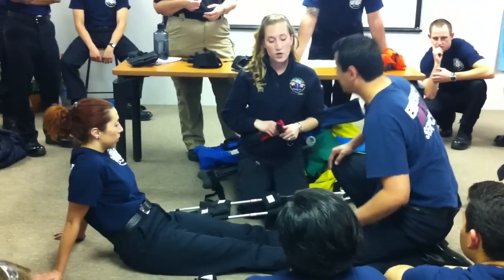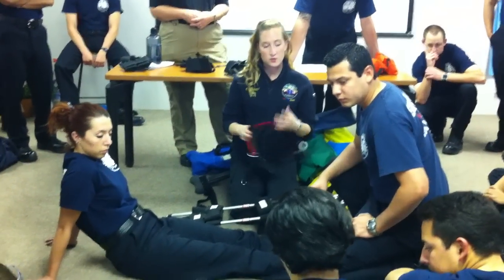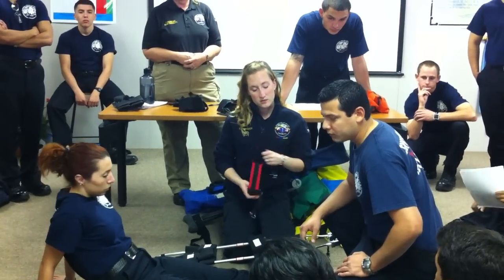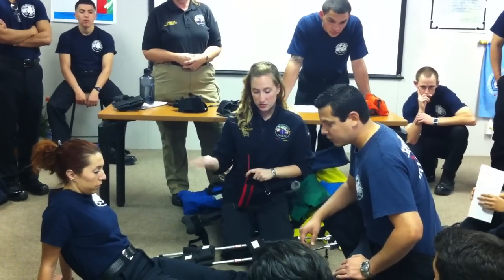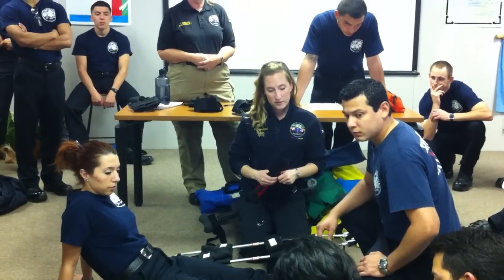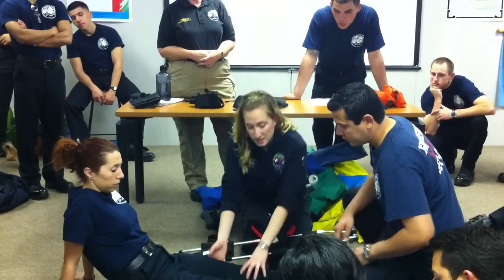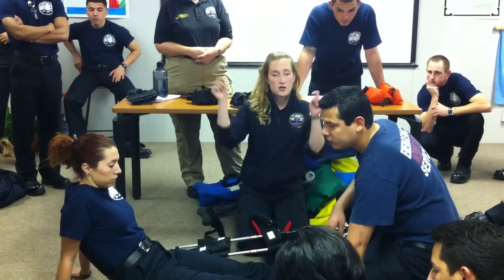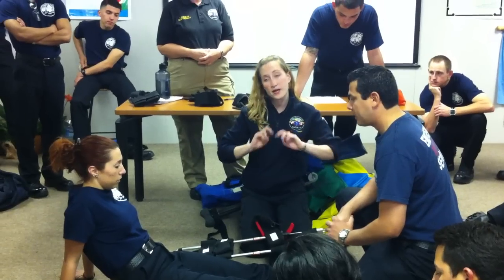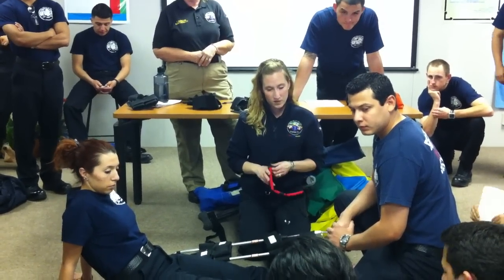Okay, the next thing on your BSI: you've cut and exposed, and you determine that she has, we'll say, an open mid-shaft femur fracture and no other injuries to her lower extremities at least. So we did the PMSC. Use somebody else to stabilize the leg when you pull off the boots and socks. Mark your pulses with a pen or Sharpie on the feet, so you can continually reassess your PMSCs. Then what? Ankle hitch and strap.